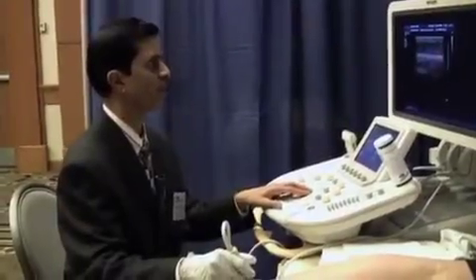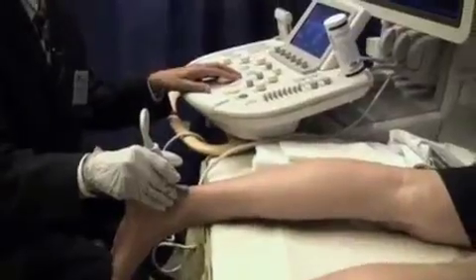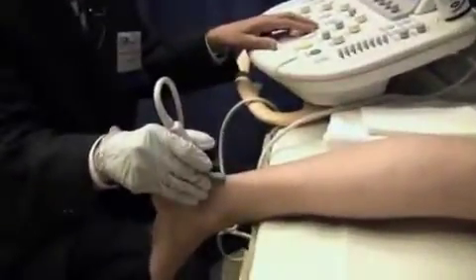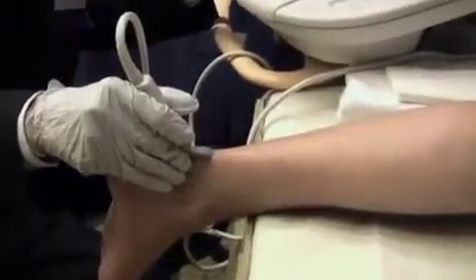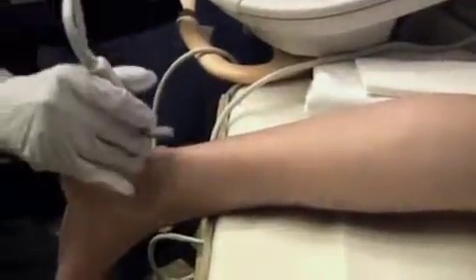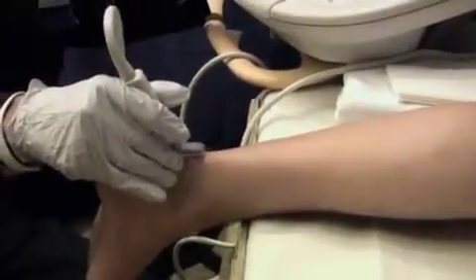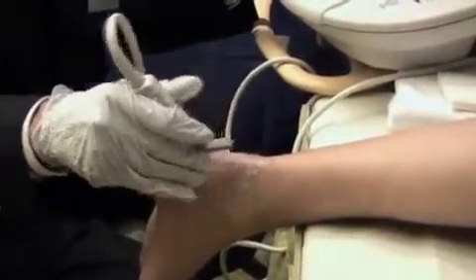The way we scan the ankle is with the patient in the prone position, lying down flat on his belly, with the foot hanging away from the table. This way you can scan most of the posterior, medial and lateral, and also it's easy to compare the other side. Once you're done with the posterior, medial and lateral, you can have the patient sit up and do the anterior portion.